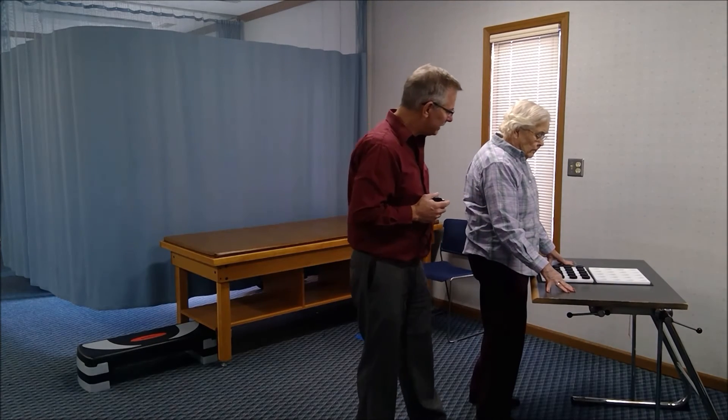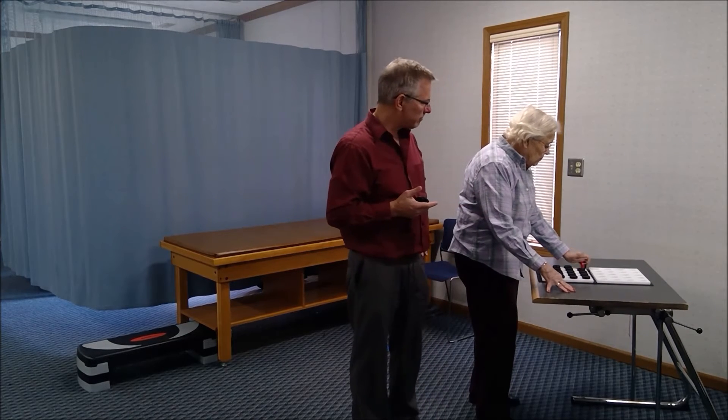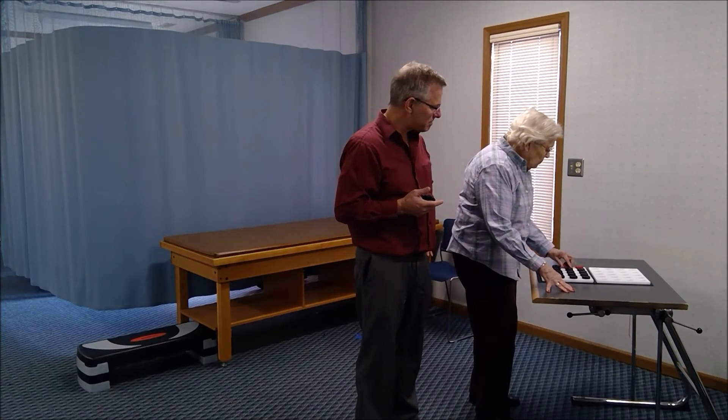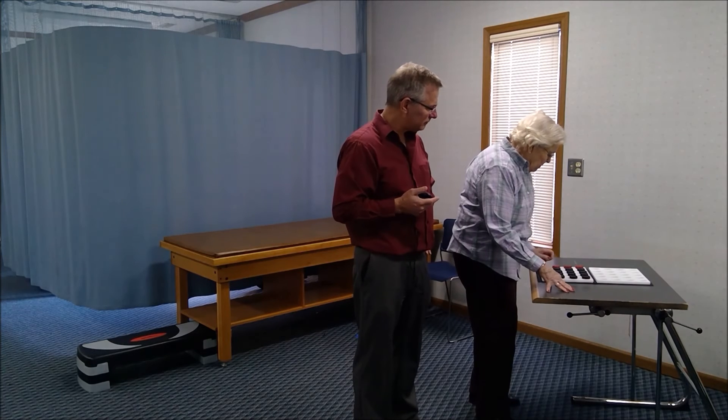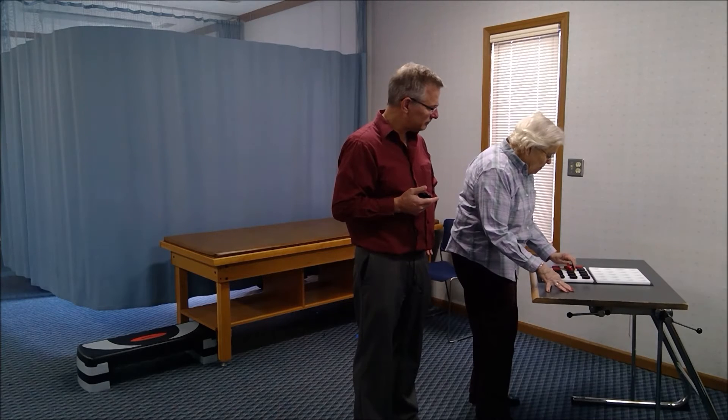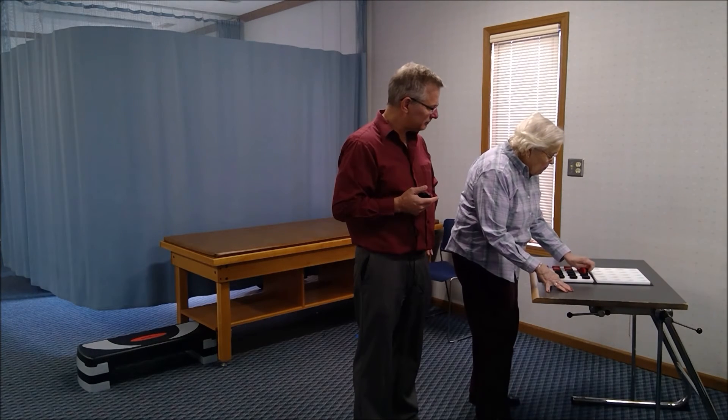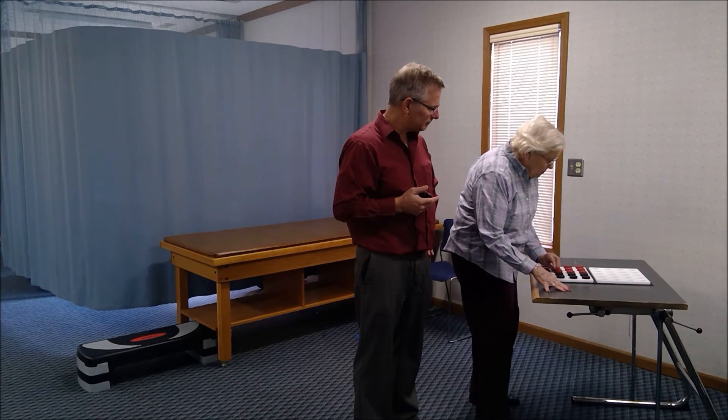Good. Now we're going to repeat the one with the left hand only. Go. Good.